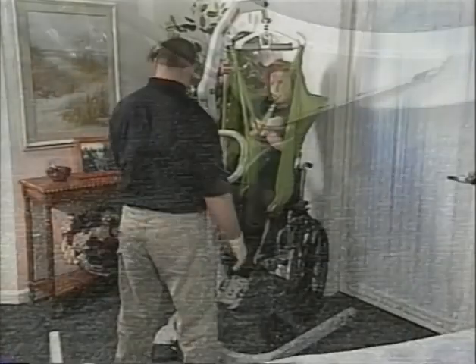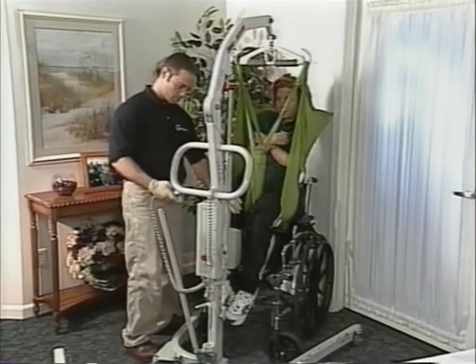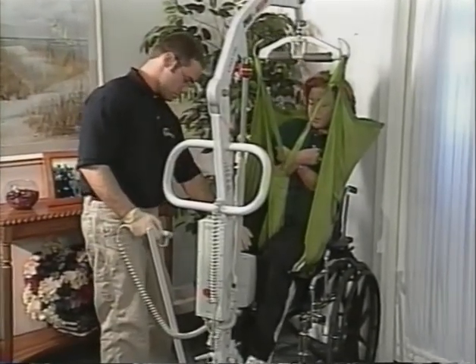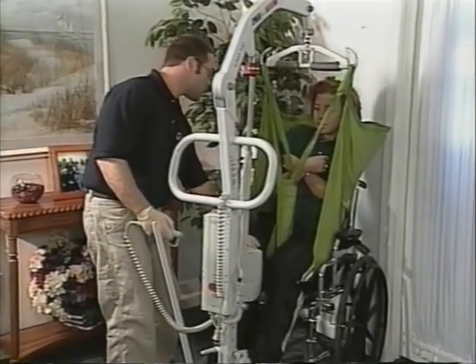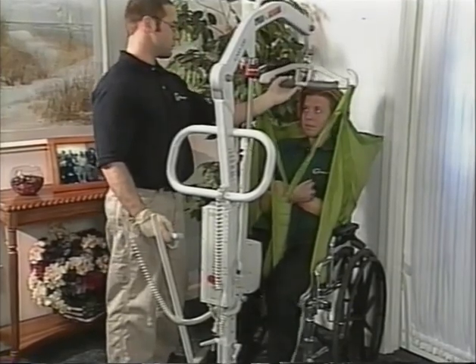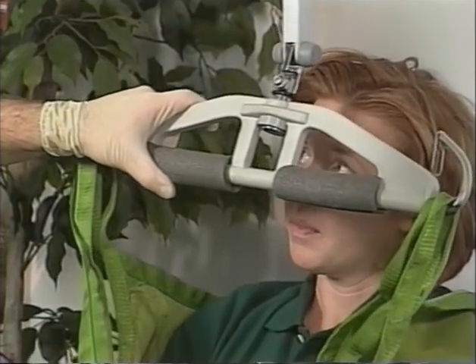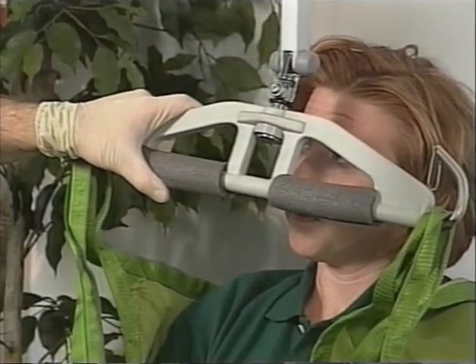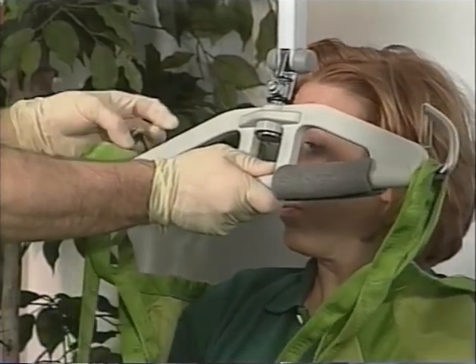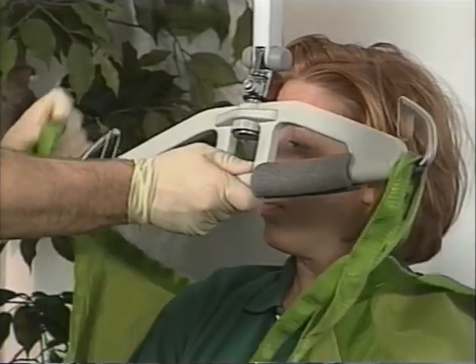Apply the lift brakes. Slowly lower the lift as you guide the client back into the wheelchair. Remove the straps from the hooks and maneuver the lift out of the way.